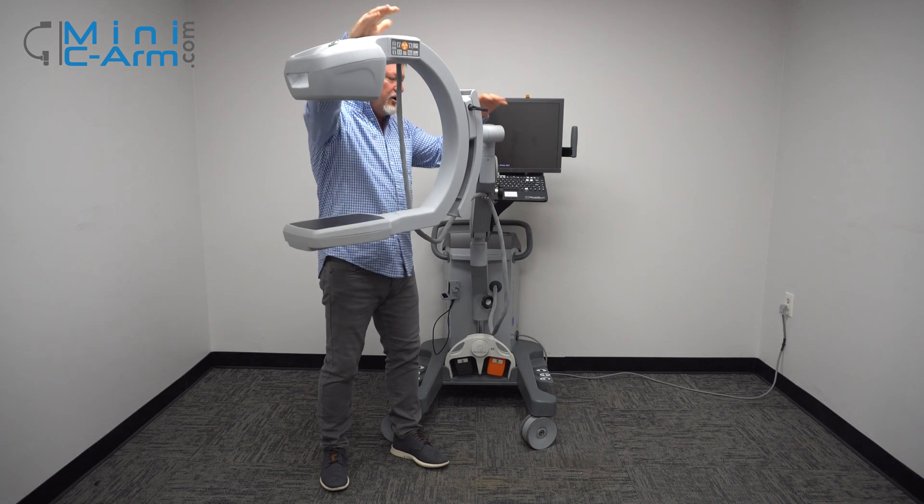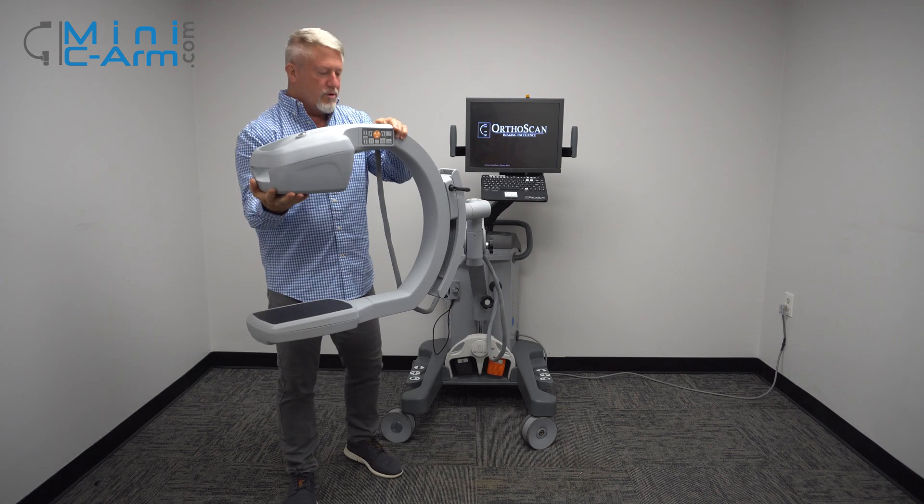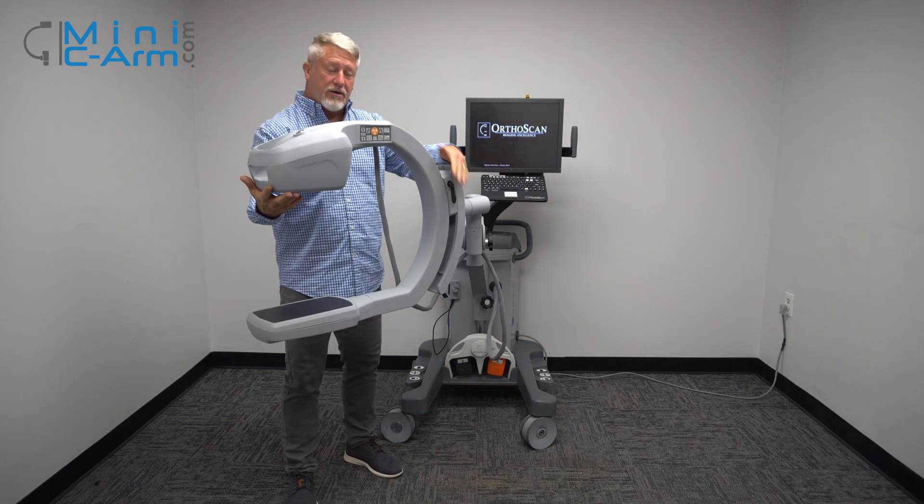This is how high it goes. This is how low. Here's our orbital rotation. Here's the lock.